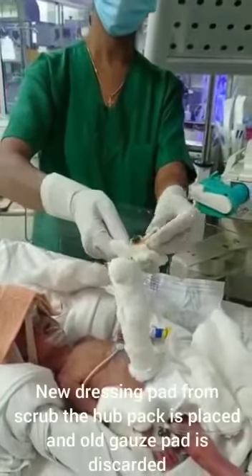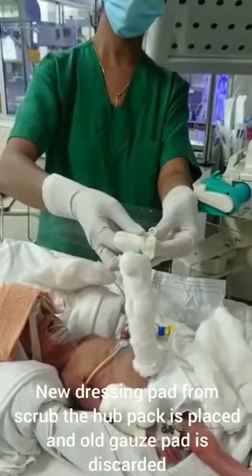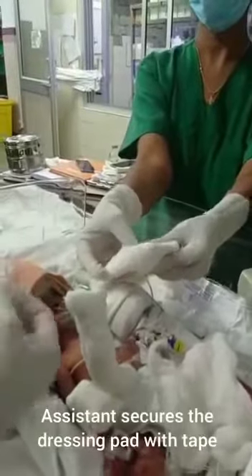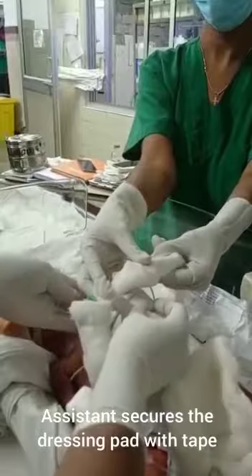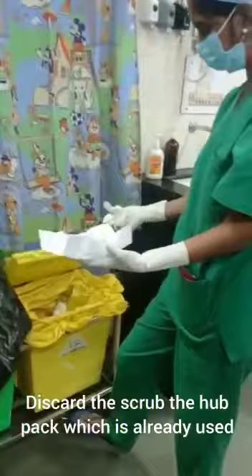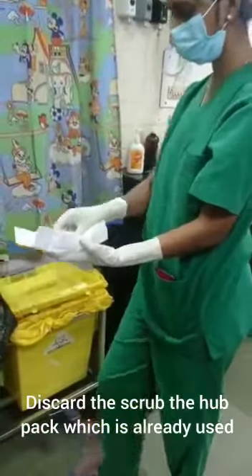A new dressing pad from the scrub the hub pack is placed, and the old dressing pad is discarded. The nurse then discards the scrub the hub pack that was already used.